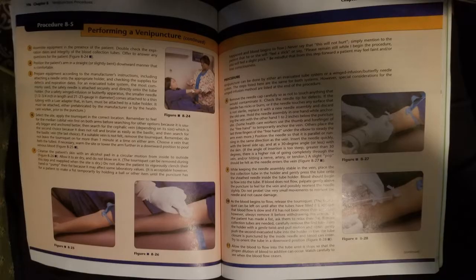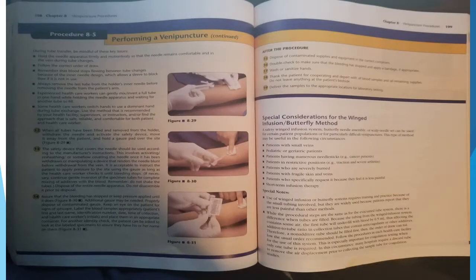Page 196 is a continuation of page 195, showing a venipuncture. Page 197 is a continuation of showing a venipuncture. Page 198 is still a continuation. Page 199 shows the completion of the procedure.